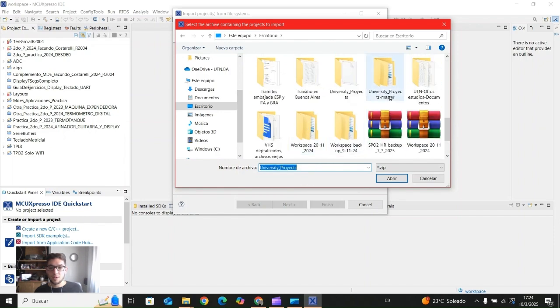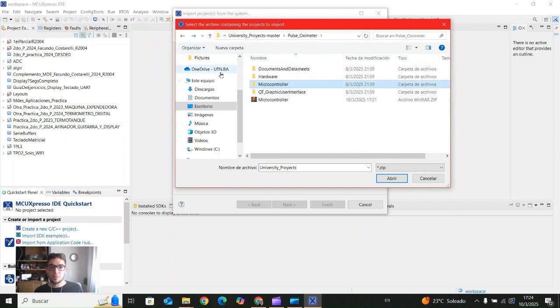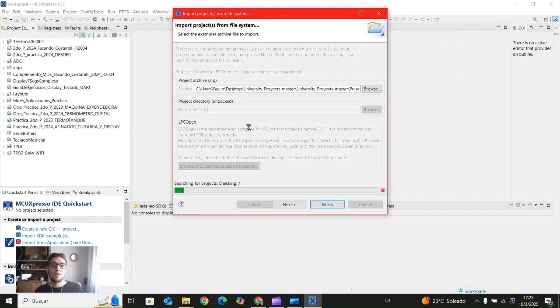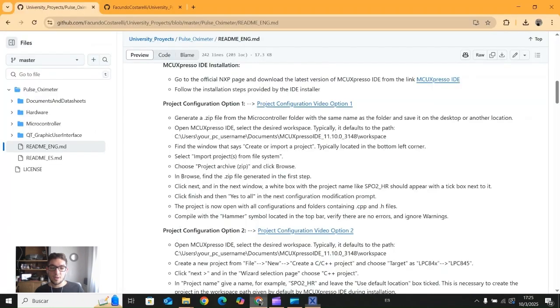What is it? Where is it? Here. Here, microcontroller. Okay, so microcontroller.zip, or zip format. So we click on open. Good.